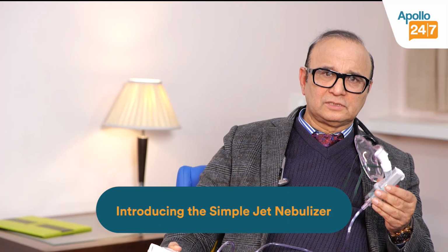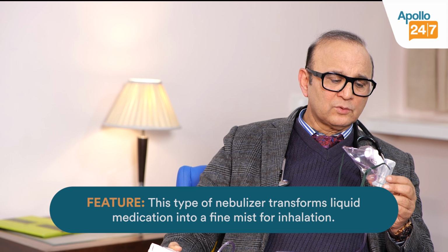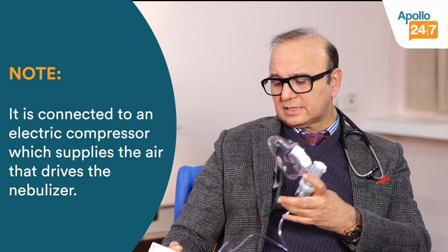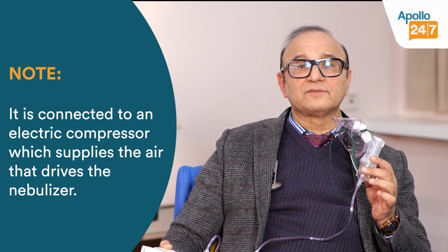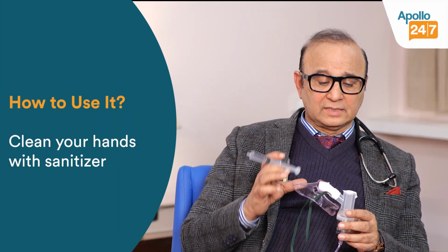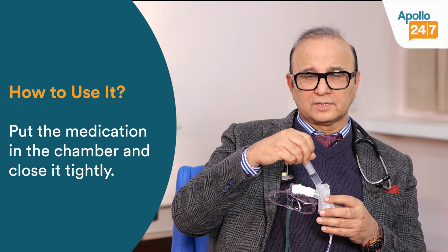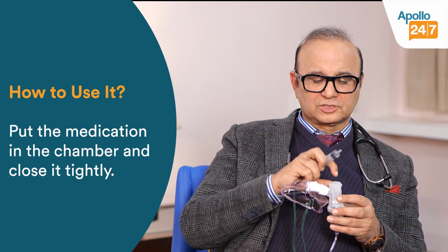This is a simple jet nebulizer which converts liquid into mist form. This chamber is a nebulizer, and this is the mask how you deliver, and this is connected to an electrical compressor which gives air to drive this nebulizer. After you have washed your hand with sanitizer, you open this, then you put the medicine into the chamber and then close this chamber.